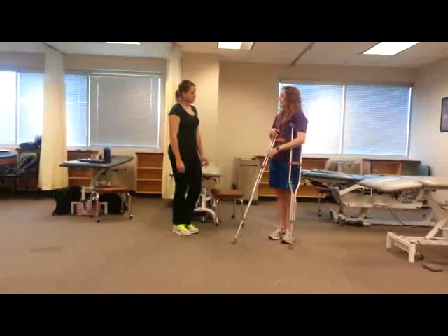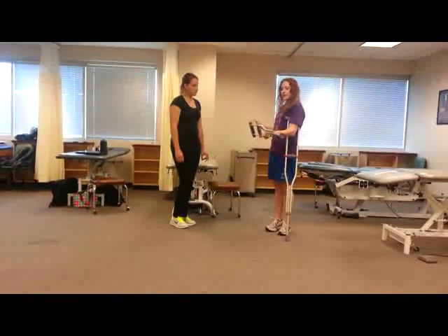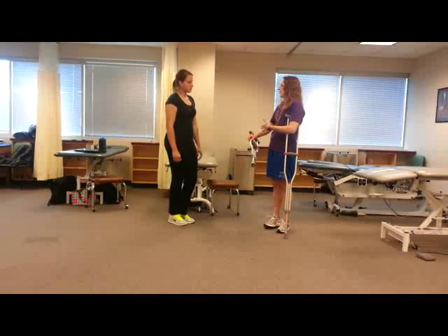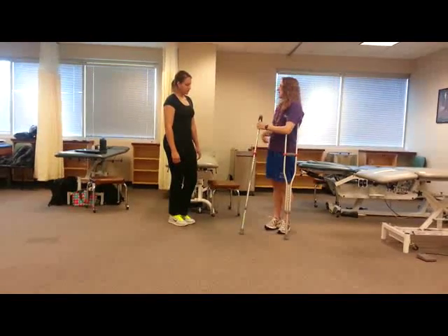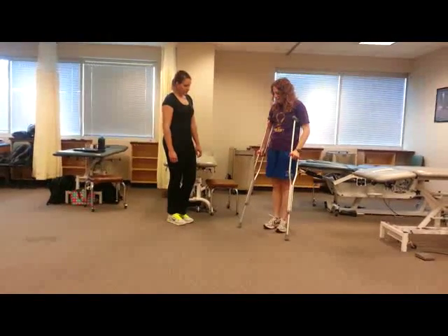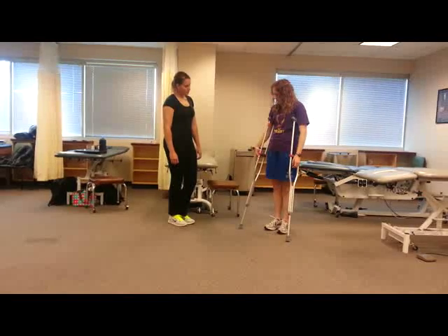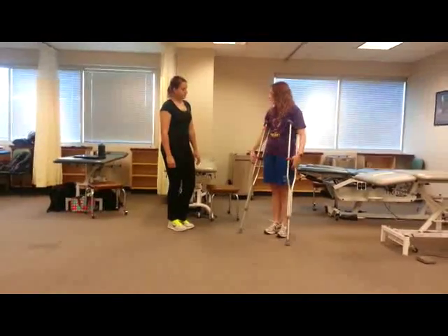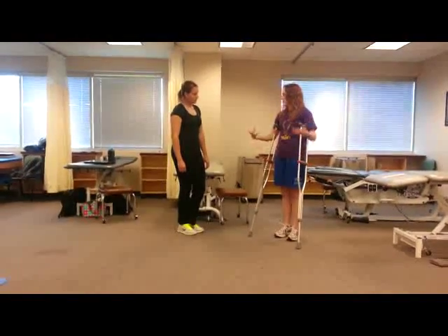If you have your patient laying down first, you can also get a good idea by just holding the crutch horizontal, just to kind of see what that distance might be, so that it takes a little less time to adjust it once they're standing up. Then once they've got the height adjusted, you want to make sure that the arm pieces are right about at their wrist, because that creates a good angle for their arms and their movement.